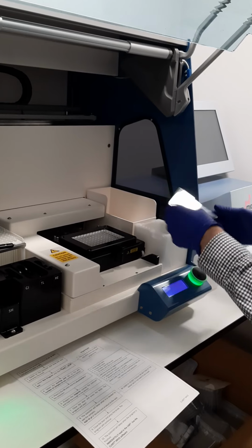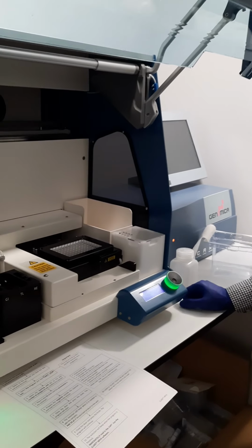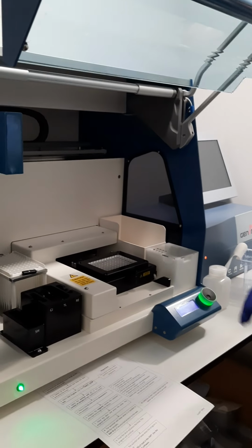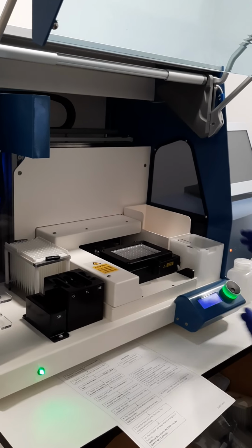Is there a specific way to clean it? No, water, bleach to decontaminate and clean and so on. Okay. And typically the lab distilled water just to clean. Yes. Okay. Alright. It's just like the bench. Okay.